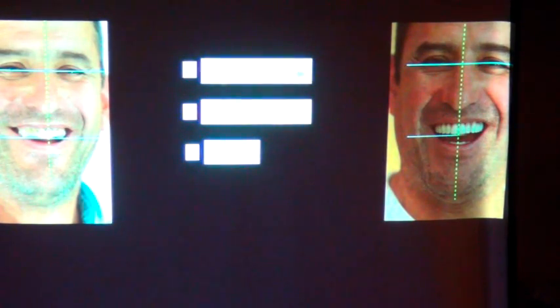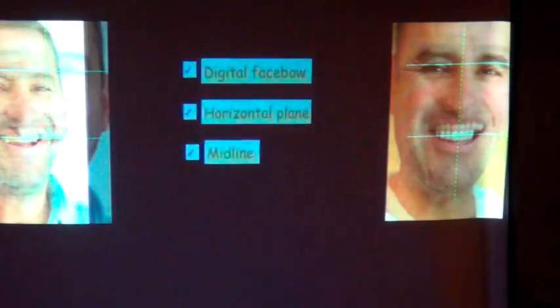There are cases that come where we see they have almost no landmarks to start with, and we have to find where to put them. We use the digital Facebow with the same concepts, and we do it to start, we do it with the laboratory, and we do it during treatment, so that when we look at the patient from multiple views, the teeth... I'm basically talking about a facial view, and in the facial view you also want to take side views.